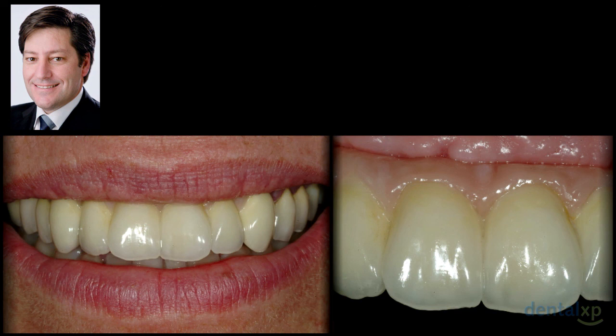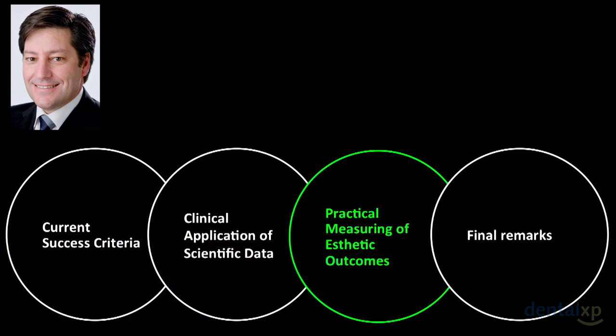We try to hide this transition line always to the lip line, but again, the integration on this patient was interesting. Now, of course, we can question a little bit the shape and the superimposition, but that's something that we tested with a provisional, and the patient was obviously happy with that.